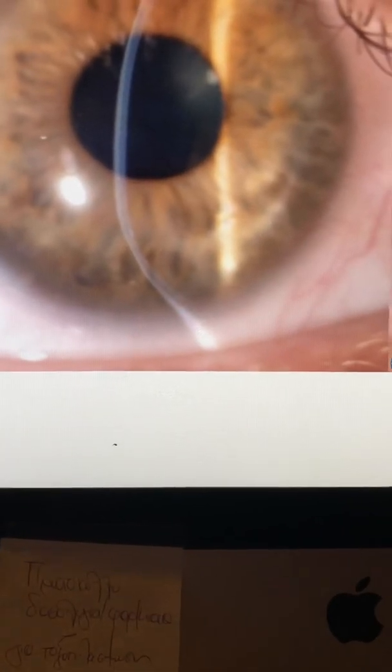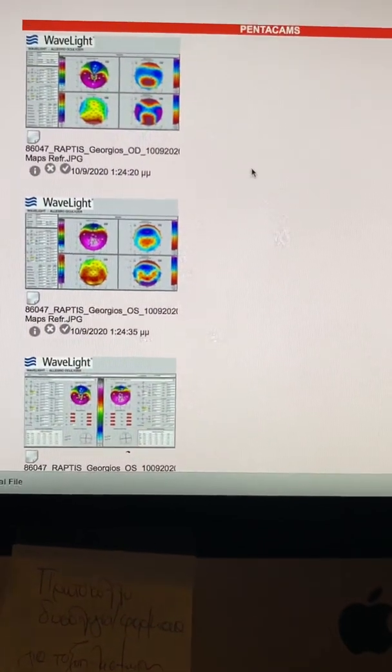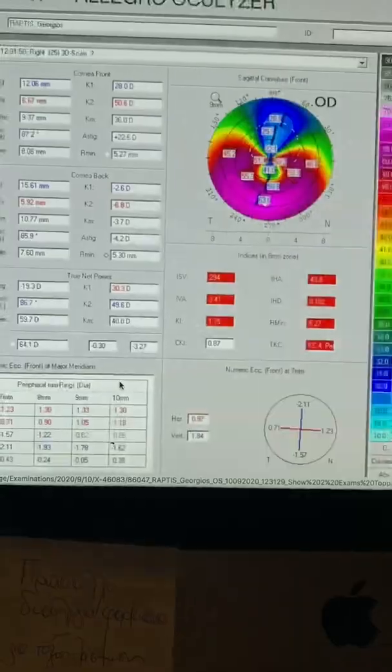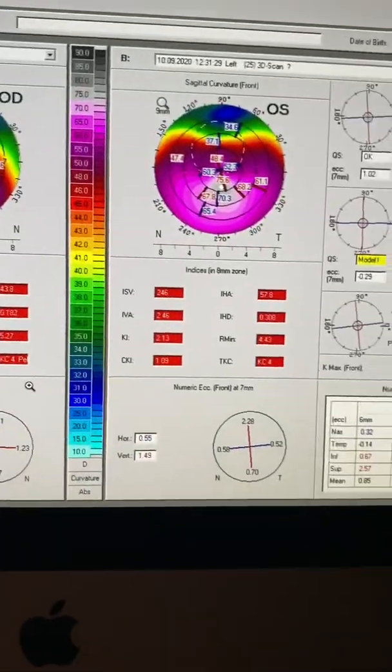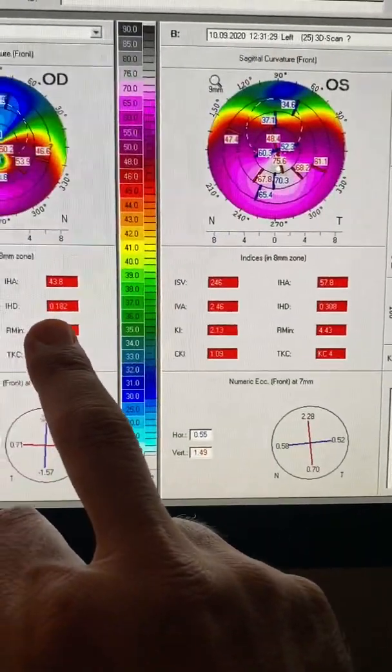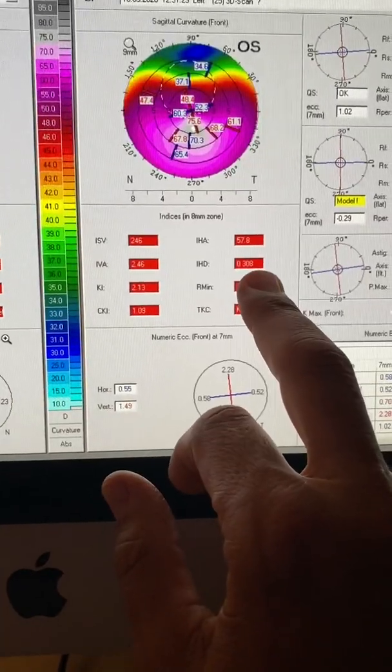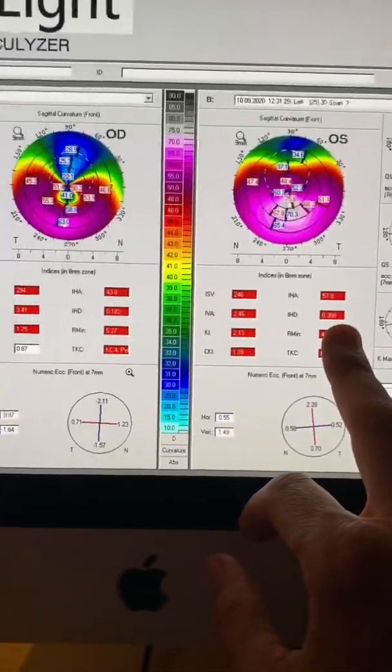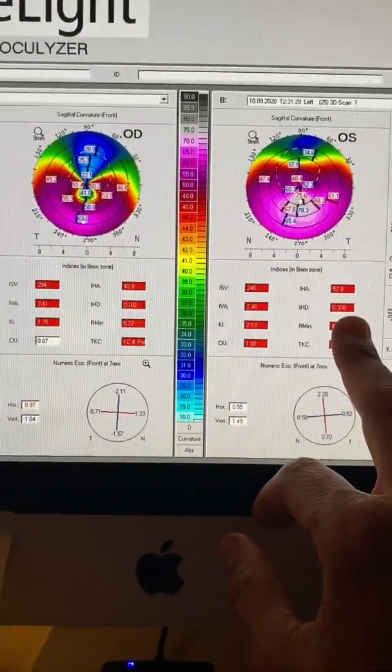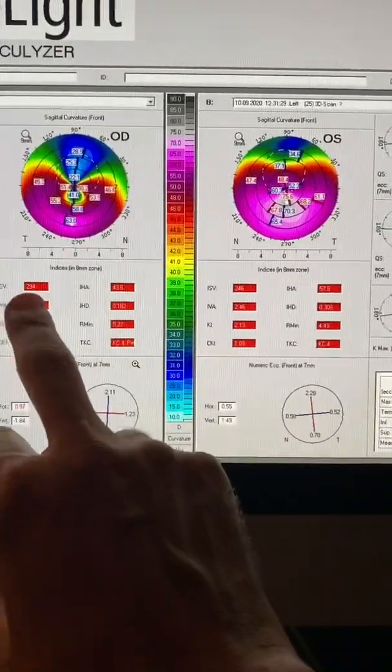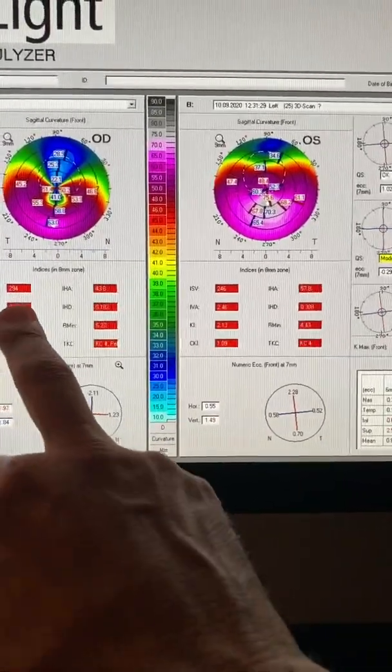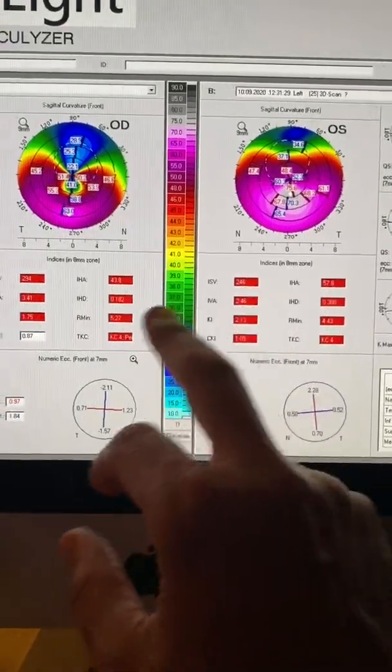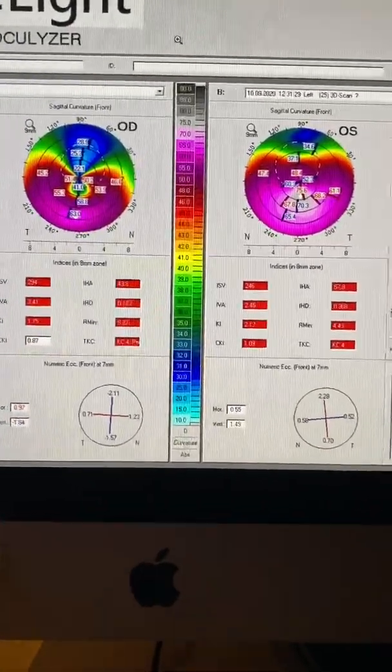So I thought I'd share this very interesting case with you. Again, crazy numbers on the IHD, 182 and 308 in the two eyes, but what's most impressive in the topometric indices are the ISVs, 294, I've never seen a number this high, and 246 between the two eyes.